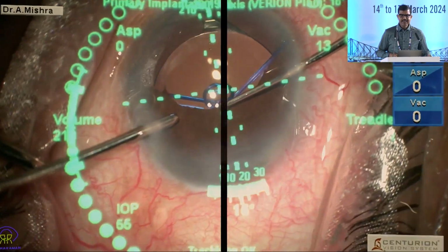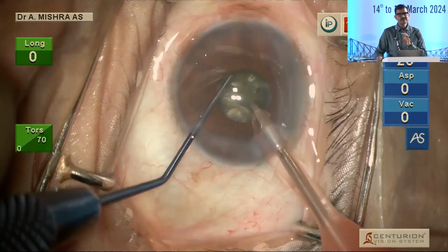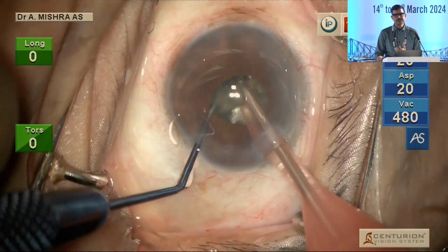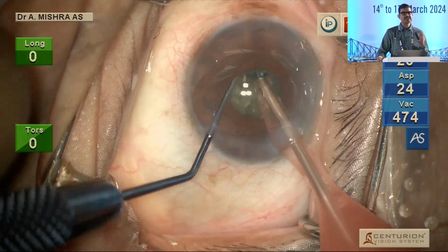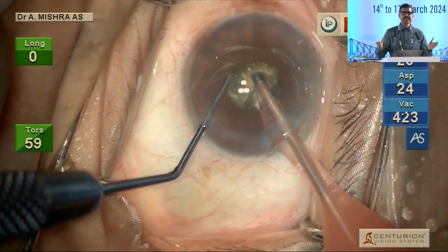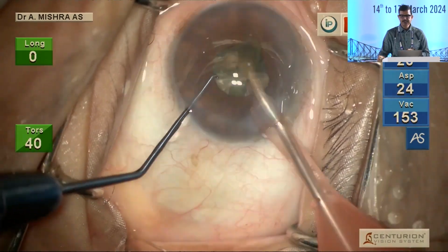But finally, all that being discussed, the final thing is maintaining or managing the nucleus without any device. Because all these devices, since they stretch the pupil, the perfect geometry and the sphincter function, the aperture function is never restored to its normal capacity in the post-operative period. So whenever we can, we should be trying to manage the nucleus without attaching any device to it.